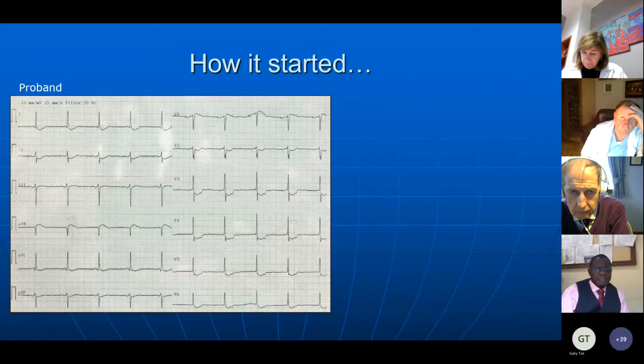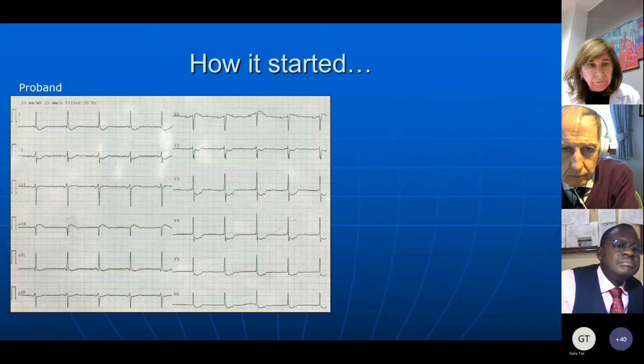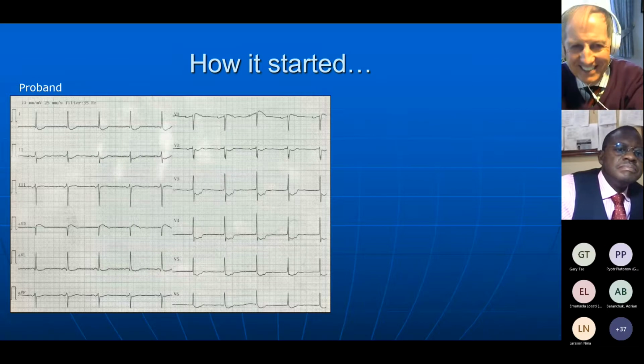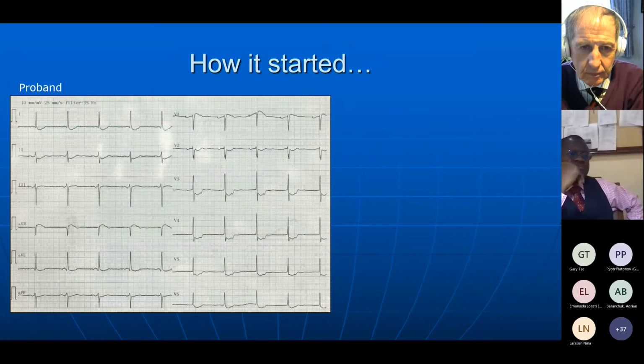Well, actually, it's something that we heard about back in the 90s when we first evaluated this patient. To be honest, it wasn't me or my colleagues, but some older, now retired colleagues who had this patient referred for evaluation due to unspecific chest pain. He had an ECG similar to this, and he was actually told to come back the next day because the ECG machine had to be out of order. But obviously the ECG pattern was exactly the same, and he had various investigations done. He had echoes, actually 2 coronary angios spread over time, and they didn't conclude that there was any underlying structural or coronary heart disease to explain these widespread ST depressions. So he was just dismissed from further clinical follow-up, and nothing was really done.